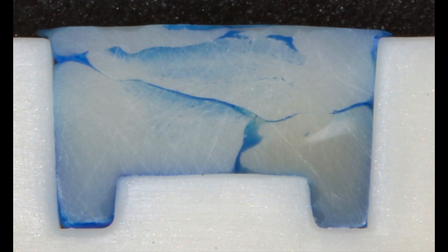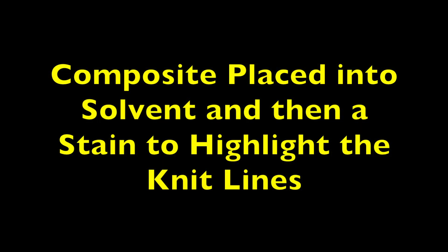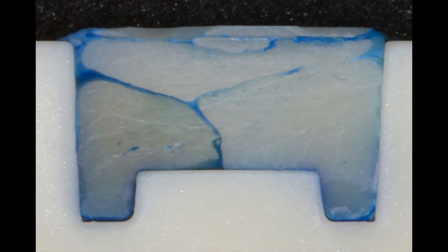Now you will see that the composite appears to be well cured, which is what we would expect. But we also see the presence of knit lines between each of the cured layers of composite. These lines have been highlighted by first placing the composite into a solvent, and then placing it into a stain.